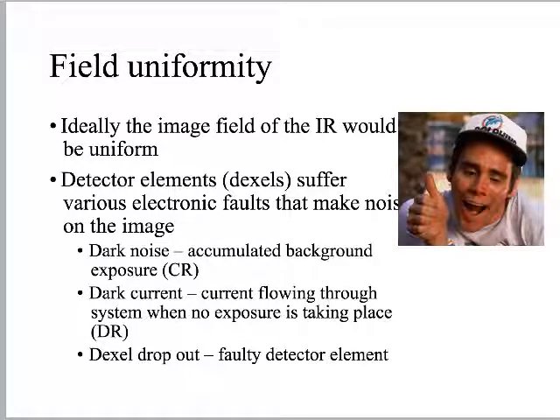So there's a whole lot of these things, a lot of little tiny detector elements on the image receptor. And if for whatever reason one of them falls out of order, then we have a blemish there. We have a way that the field is not uniform. There's like a pimple on the image receptor now. So there can be all sorts of faults that result in that blemish.